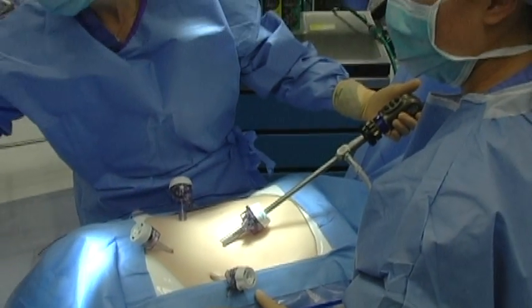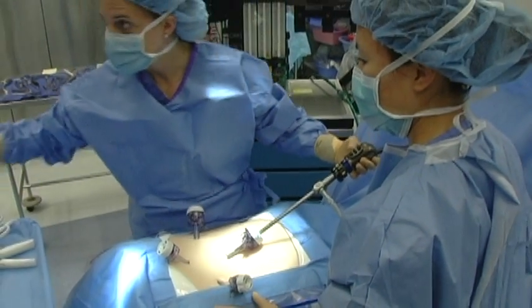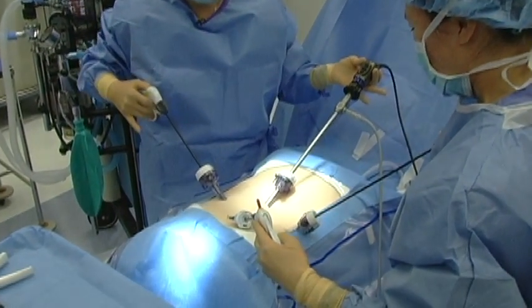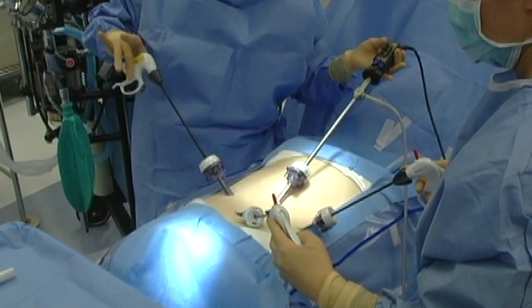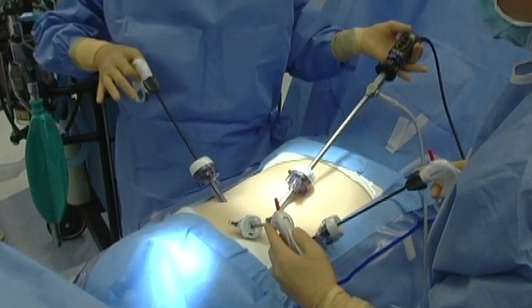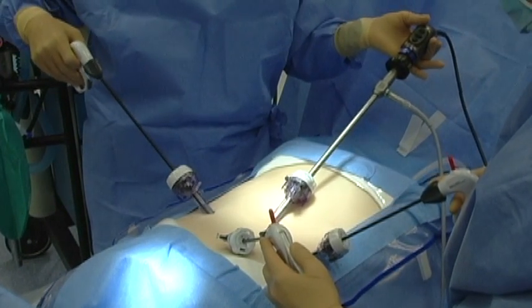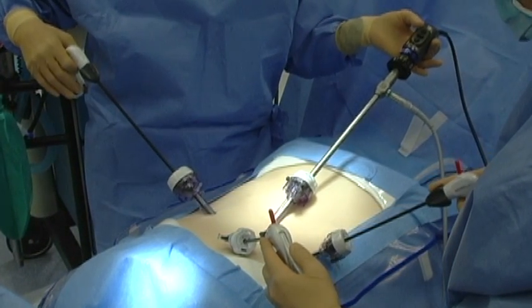I'm going to start demonstrating the anatomy using a blunt instrument just to identify what we have. Now when you do this, remember that your camera screen is down there, so to physiologically be comfortable while you're operating, you're going to want to switch hands. Use your right hand in the suprapubic port and your left hand laterally.